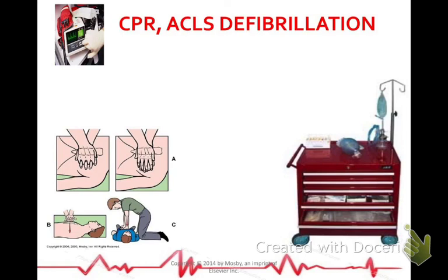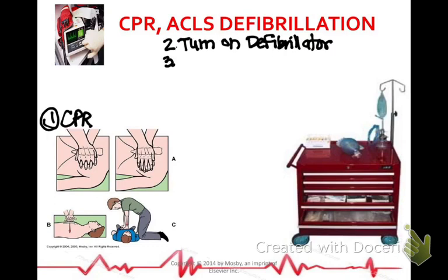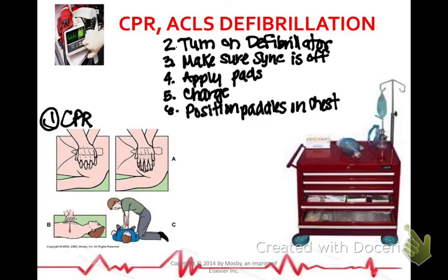So we don't expect you all to know ACLS, but we do show you just the process of it. So your CPR, good quality CPR, is the first step. Turn on your defibrillator. Make sure your sync button is off. This is all from your book.